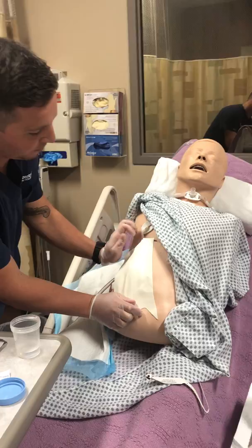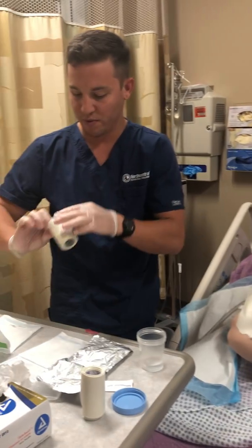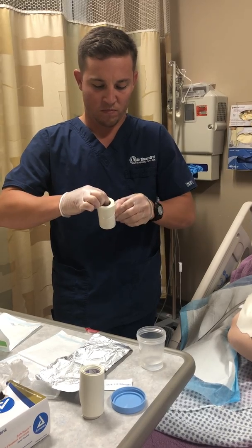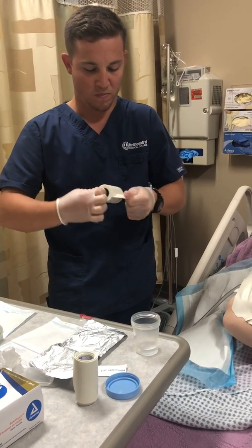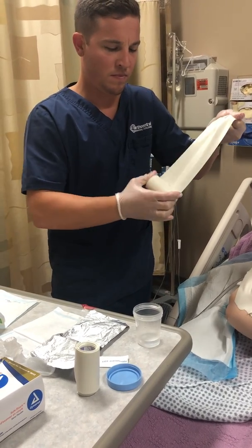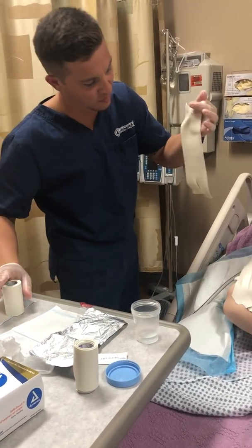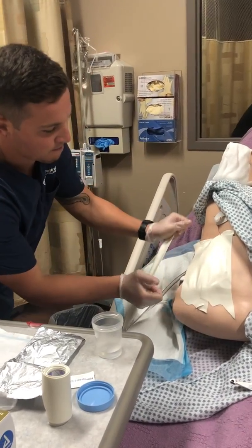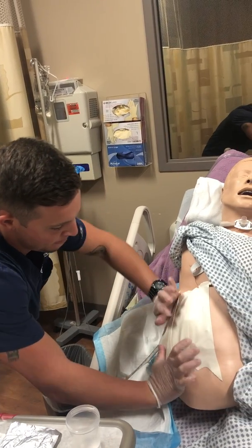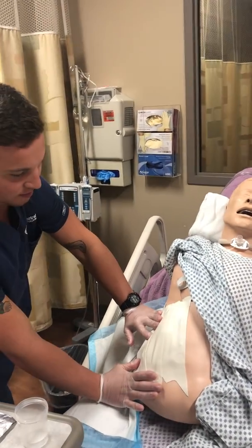Obviously this would stick a lot better to a human, like this. Do one more. Good. So, right here. Okay. All right, now we got our airtight seal.